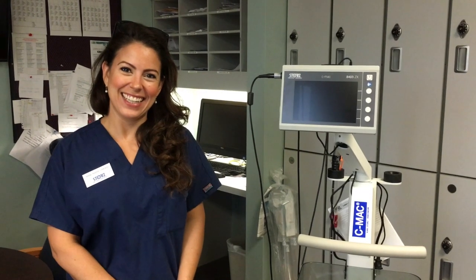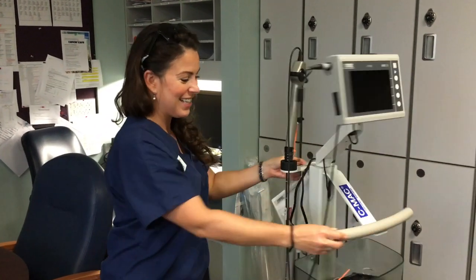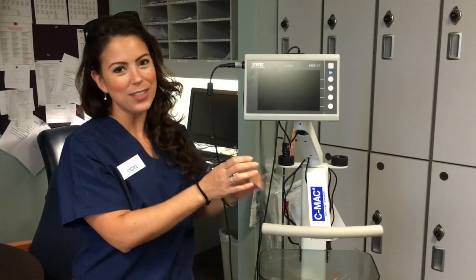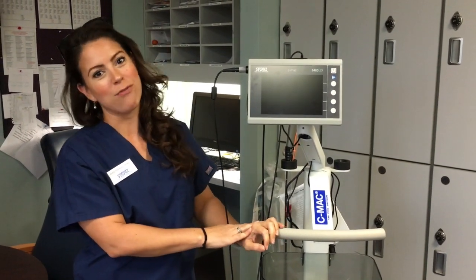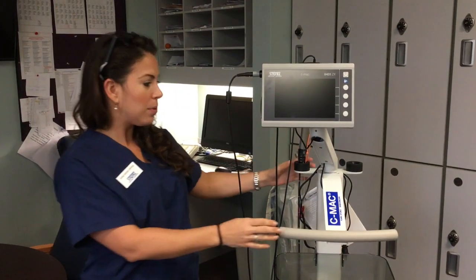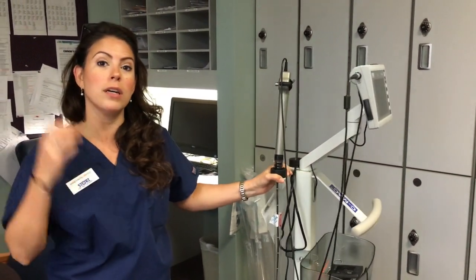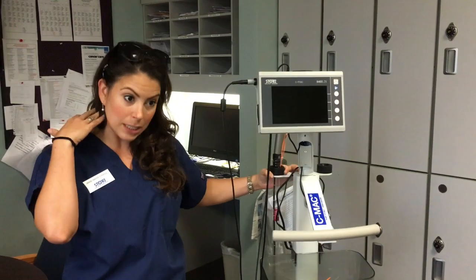We have Annemarie here from Stortz with our new incredible equipment. This is your new latest and greatest updated CMAC airway platform — your one-stop airway solution for any standard or difficult airway. You used to have the old monitor in the blue bag and the pocket monitor. Plus you now have a brand new flexible scope for patients with angioedema, small mouth opening, or C-spine. That's going to be a really great tool.